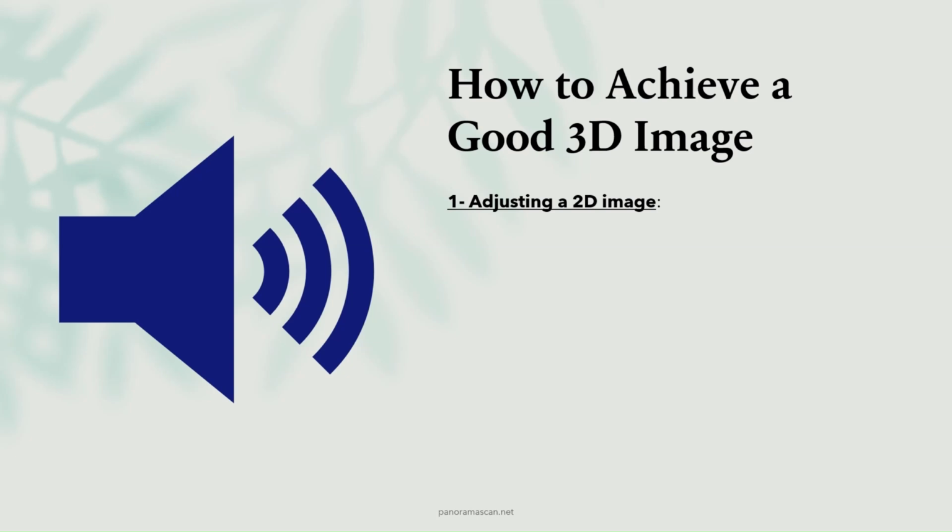Before acquiring the volume for 3D imaging, it is essential to ensure that the 2D image has the best possible quality. The 2D base image serves as the foundation for accurate 3D reconstruction, so optimizing this image is vital. This step includes making adjustments to several parameters that directly affect image clarity and resolution.